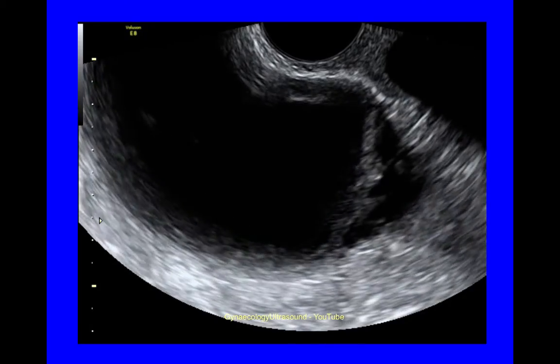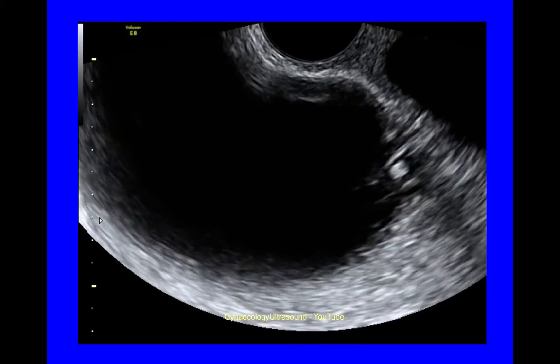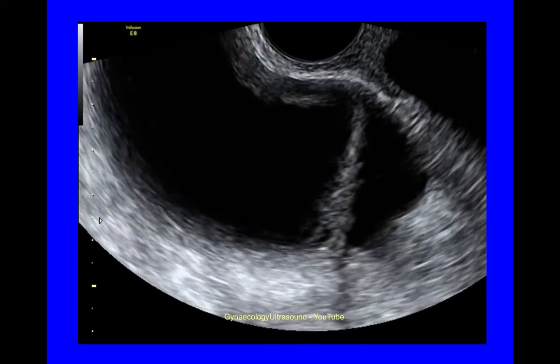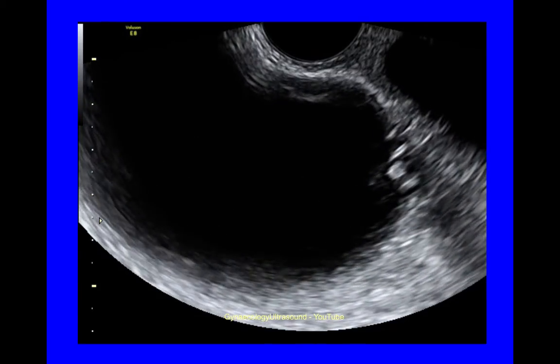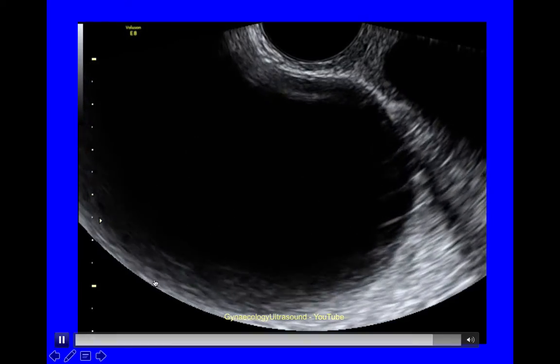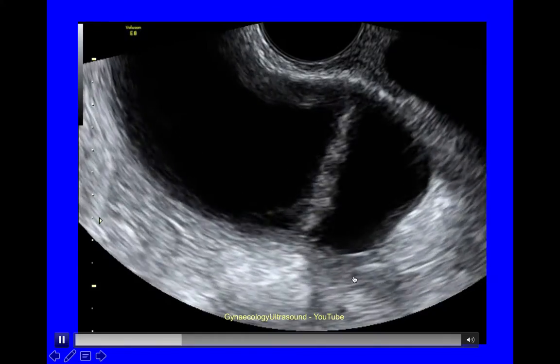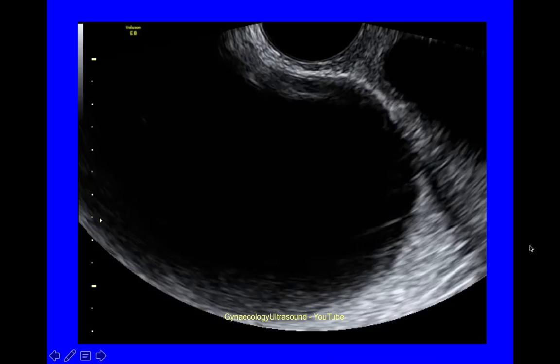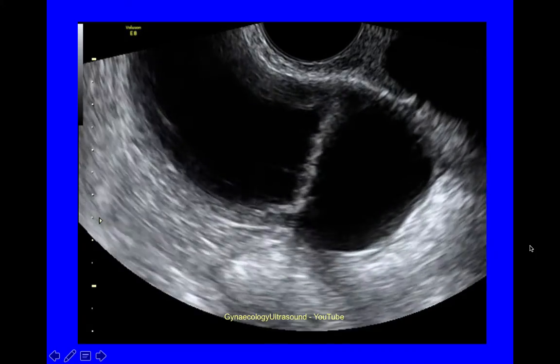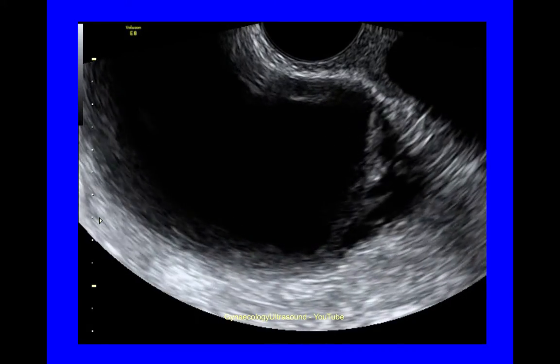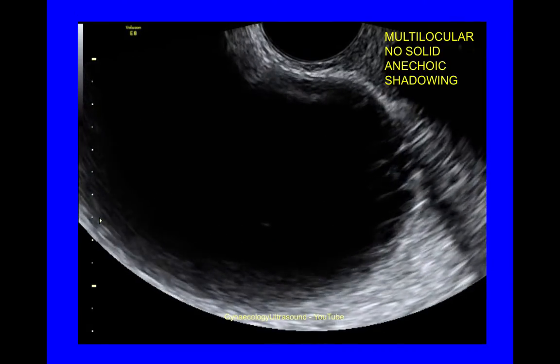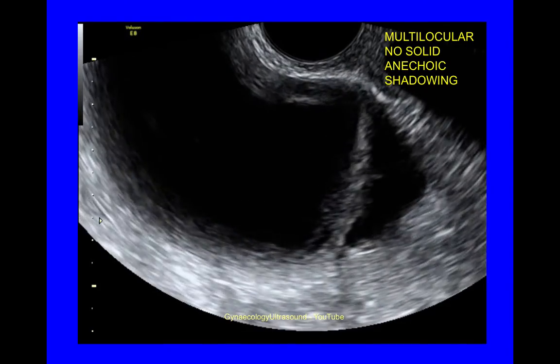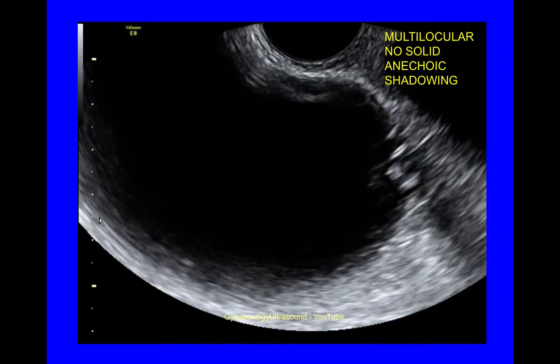This is a video showing a multilocular cyst with no solid material, anechoic cyst contents, and some shadowing. You can see the shadowing posteriorly. It's entirely regular — multilocular, no solid material, anechoic with some posterior shadowing.